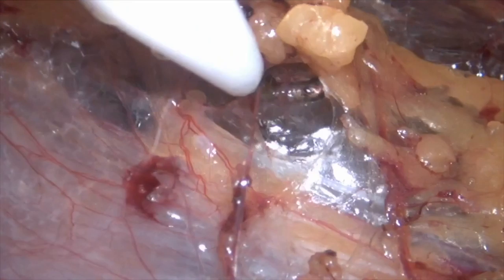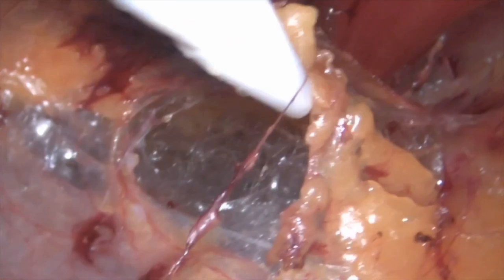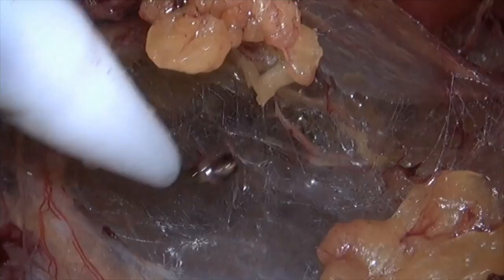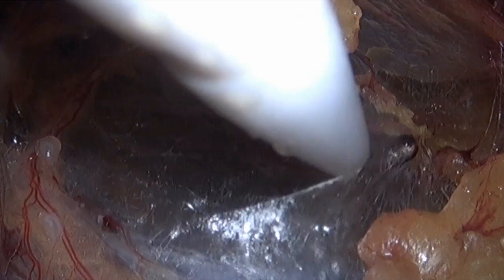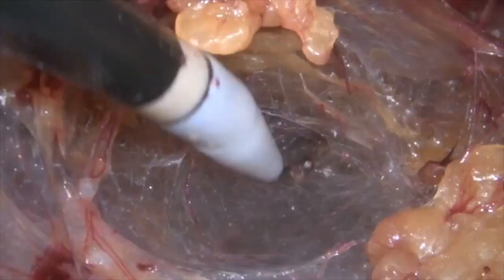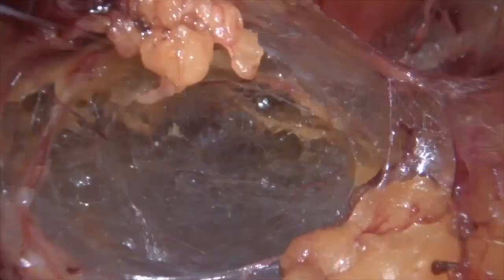The major advantage with the e-TEP is that you have a very wide space, and the possibility of a peritoneal injury is quite low because you have a good distance of the posterior rectus sheath available for you to initially create the space. So whenever you're in the initial learning curve, e-TEP is a good procedure to perform. So now if you look carefully, there are two planes which we can work on. This is the right plane which I'm working on right now, but my telescopic dissection initially was done in the wrong plane.